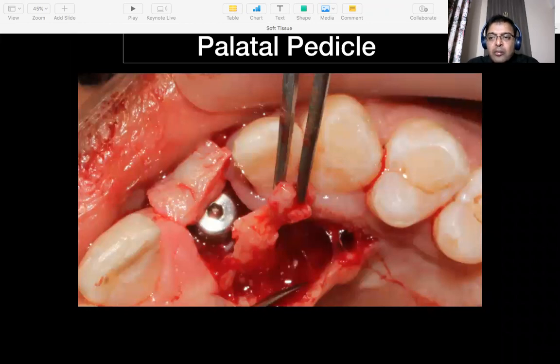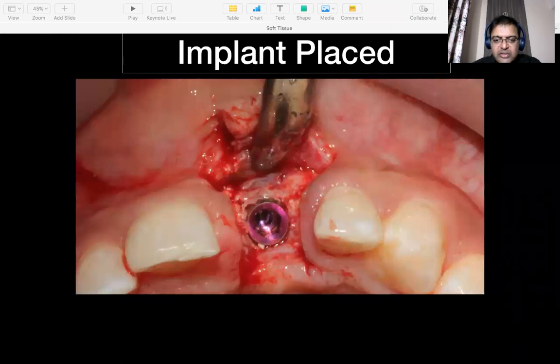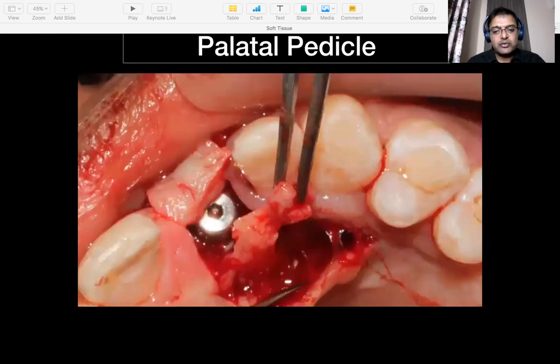Now, to enhance the amount of soft tissue and protect the bone, if you go back to the slide, you see that the amount of bone present on the buccal of the implant is okay. Now, the consensus statement stated that it's very important to have an adequate amount of connective tissue and soft tissue thickness, and this soft tissue thickness would in turn guard the amount of bone that's available. If I had 4 mm of bone and thin tissue, I would lose bone. But if I have 1 mm or 2 mm of bone and I put a good tissue, then I would guard my bone. And exactly that's what we did.